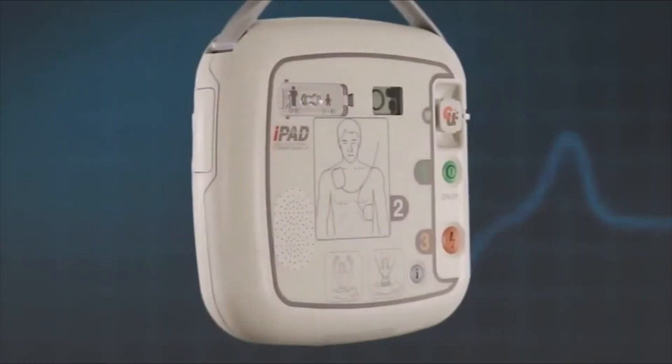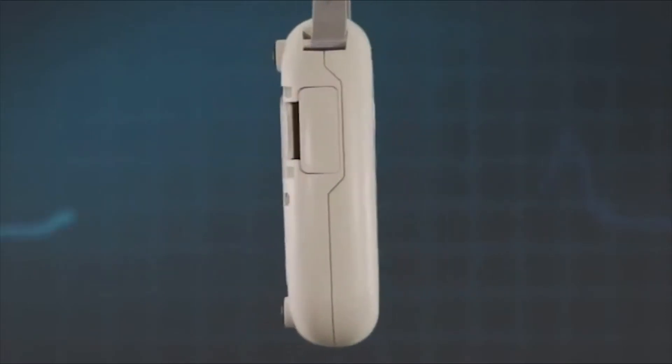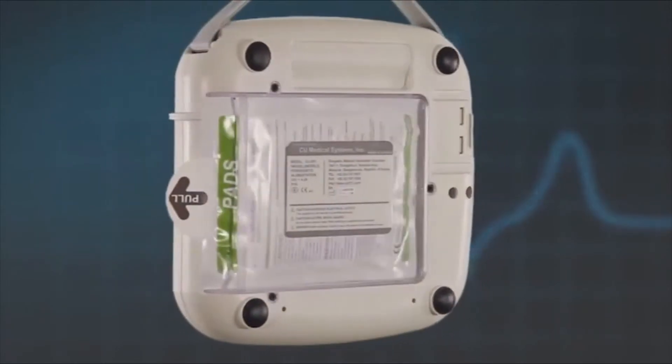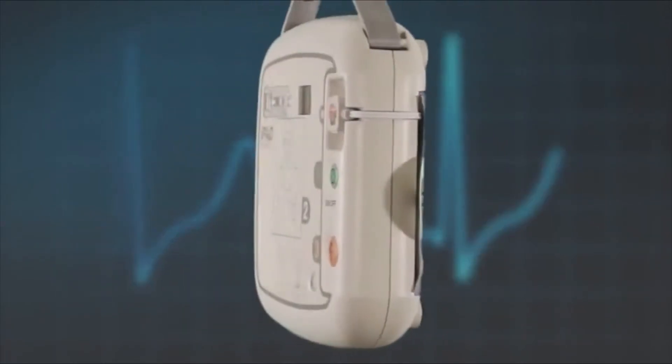The iPad SP1 AED is a robust AED that holds a water resistance rating of IP55, and it has passed drop tests to all sides and corners from 1.2 meters.